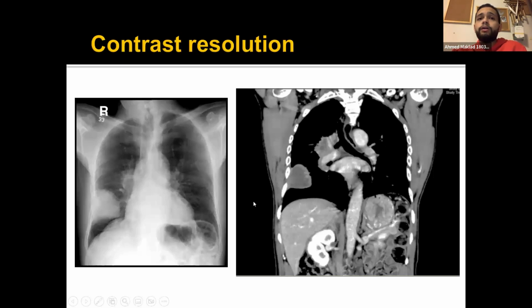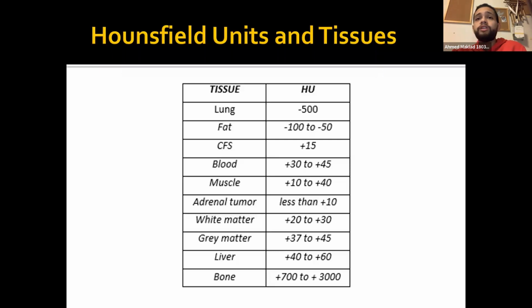All right. Contrast resolution, how is this different from X-rays? It's not different, it's just we quantify it in CT. We care how much X-rays different types of the body absorb, because later on, I'm going to talk about window. And window is important because that's where we use Hounsfield units.